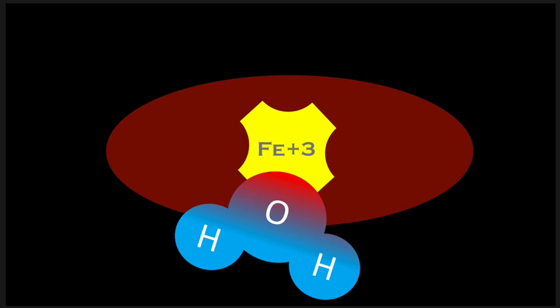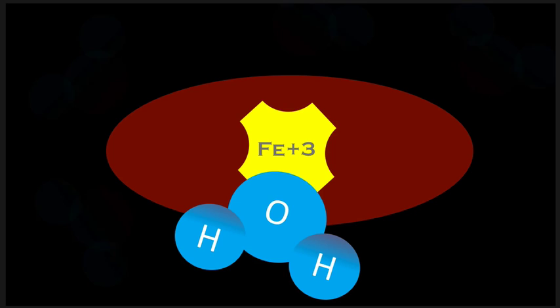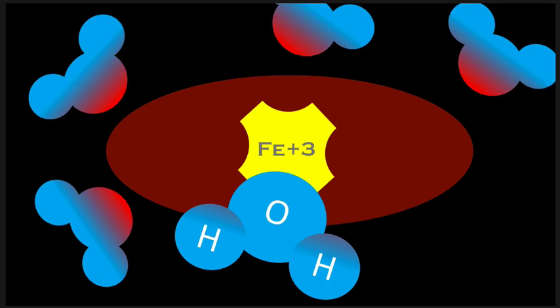And people who pretend to understand this stuff call this an inner sphere relaxation. So basically, what happens is it chills that oxygen out. That interaction right there makes it so that it's not doing that pull thing as much as it was before. And it doesn't just happen there. There's like a cascading effect where it sort of spreads to all the local water right there. So they all sort of chill. And now they lose that fast spinning that they were doing. They're not doing that anymore.